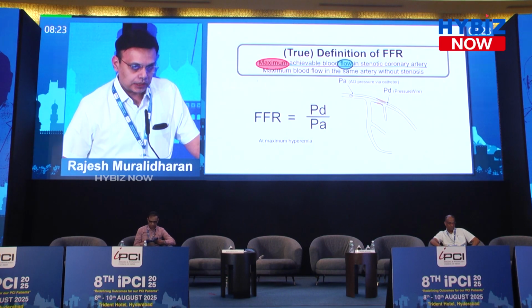FFR, by definition, can be measured only at maximum hyperemia. There is nothing called the baseline FFR. If you are to tell that you have measured an FFR, you need to induce maximum blood flow, maximum vasodilatation, maximum hyperemia, and then only you can tell that you have measured an FFR.